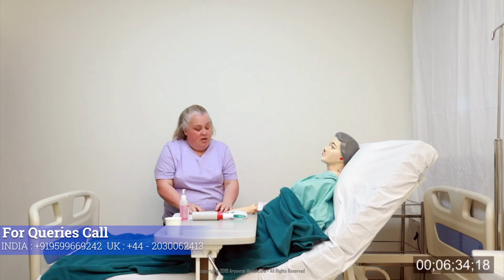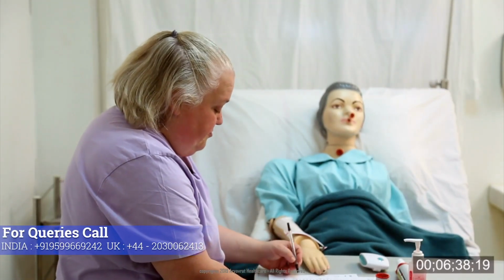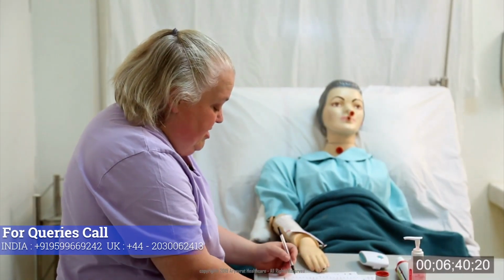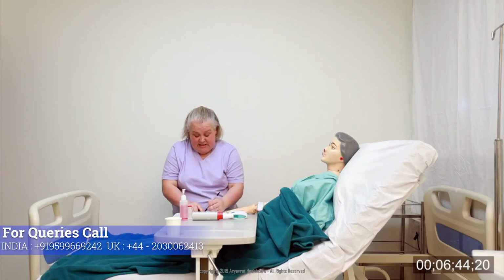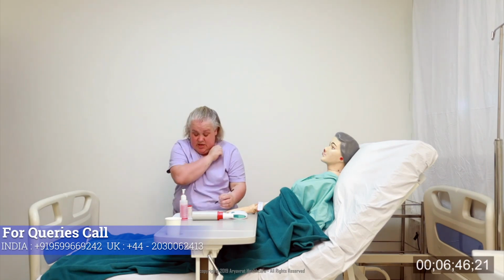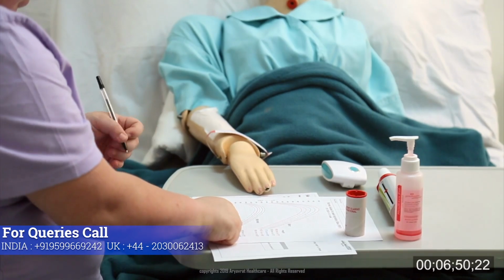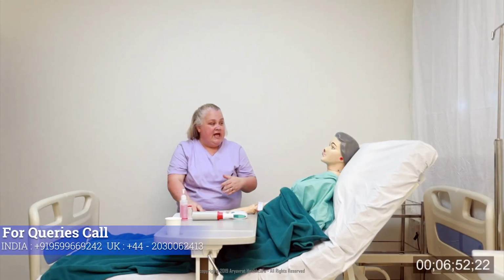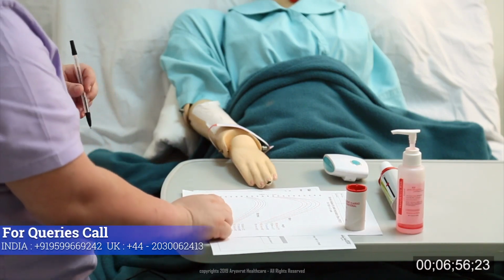So, how old are you, Helen? Remind me. 69 years old. 69. And do you know how tall you are? Yes, 165 centimetres. 165 centimetres. So that says here that your expected value, what we're aiming for you to get, would be 370.